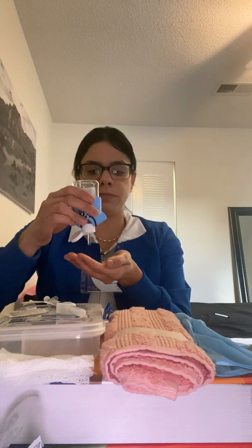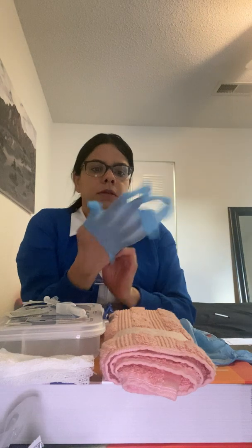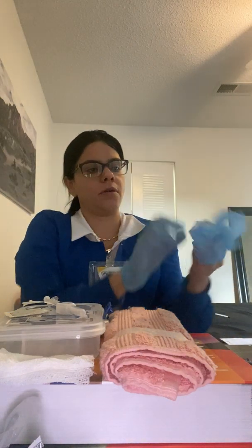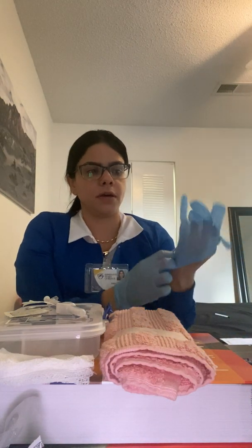Alrighty, so now that I have that, I'm going to clean my hands. And I'm going to put my gloves on. Okay, now that I have my gloves on, I'm ready to continue.